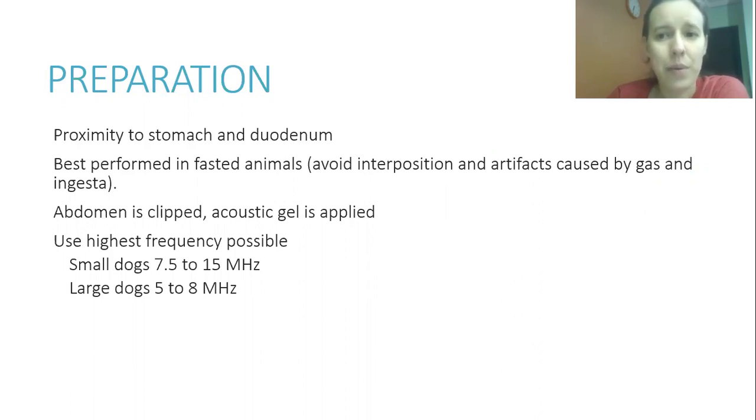Preparation for the exam is especially important when looking for the pancreas. The fur is clipped and acoustic gel is applied. You should use the highest frequency you can — typically 7.5 to 15 MHz for small dogs and 5 to 8 MHz for large dogs.